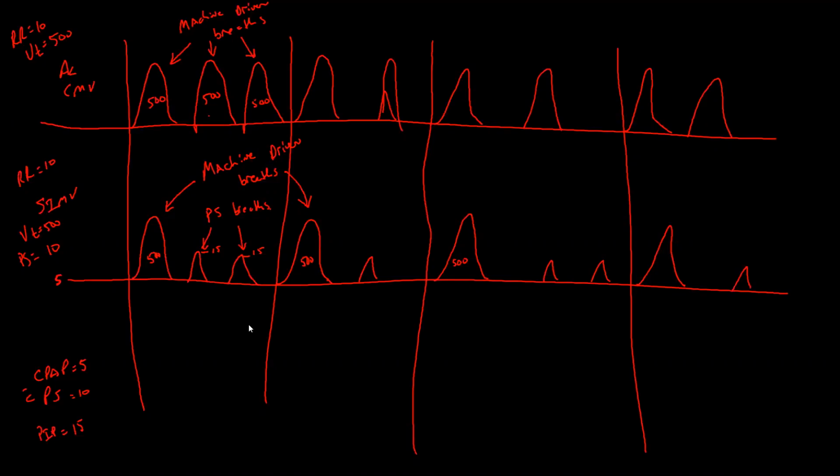Okay. So here's the thing. Let me talk to you about it in terms of CPAP for a minute. When we have a patient at our hospital, our physicians aren't big fans of SIMV. They say, look, you're either ventilating this patient and breathing for them, or else you're weaning the patient. Which one are you doing? If you're ventilating, the patient needs that support, keep them in assist control or whatever mode gives them the full support. If you're weaning the patient, put them in CPAP. And so that's what we do.